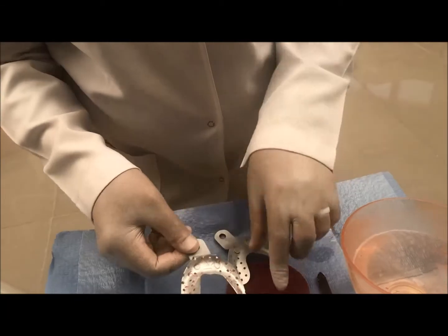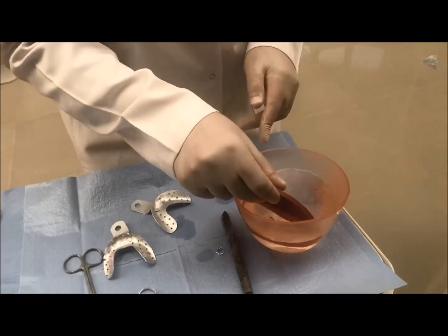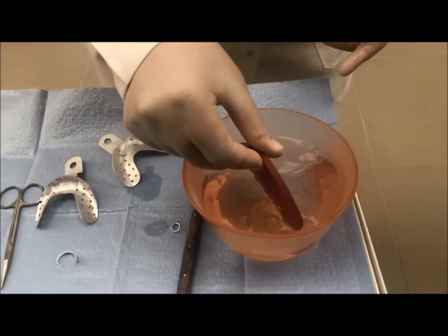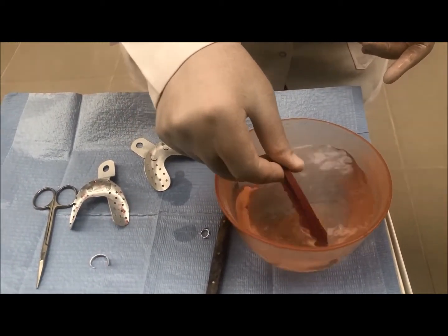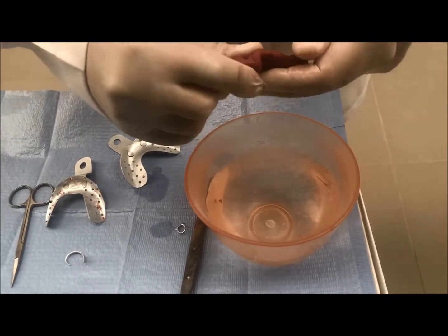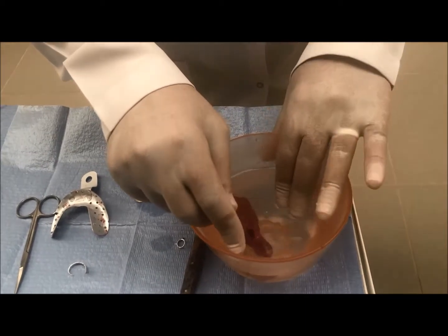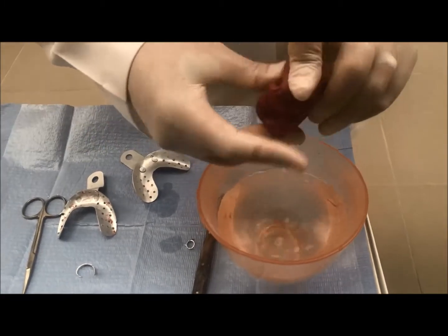The tray is now ready to take an impression. I will use impression compound for making the impression. Do not throw the impression compound inside the rubber bowl, otherwise it will stick to it. Keep the material inside hot water until it is soft. Be sure that the water itself is very hot — otherwise the material will not soften.